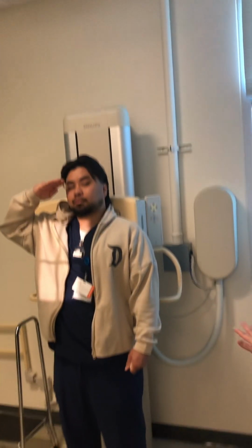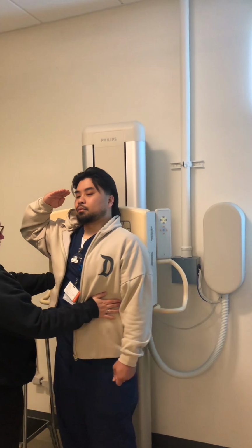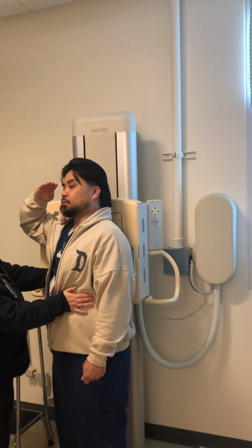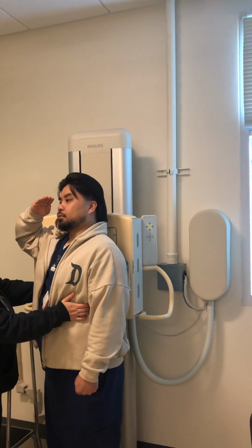Anybody have to put BBs yet? That may be another thing that you're going to do in this process, is to actually put a mark somewhere where the patient says there's the most pain. Would you put the BBs on the patient, tape them to them, or would you put them on the board? To the patient. Okay.